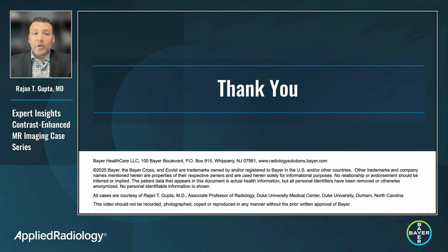So as we conclude, I hope that this has been a helpful review of the use of EOVIST in clinical practice. As you can see, I've used the agent for many years, and I've tried to show you real examples from my clinical practice where I found that it's helped me. Specifically, we talked about the use of EOVIST in the detection and characterization of focal nodular hyperplasia versus adenomas, and also showed you its use in metastatic disease, both of the hypervascular subtype as well as the hypovascular subtype. I hope this has been helpful and hope all of you have a great day.